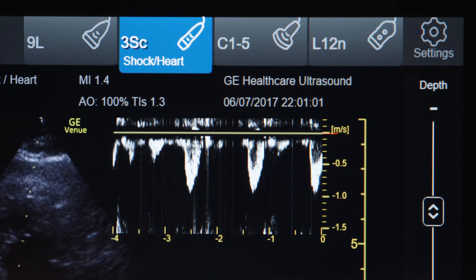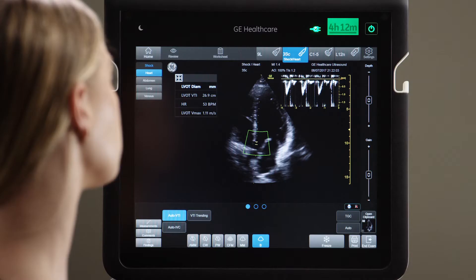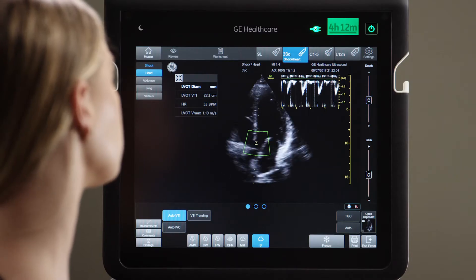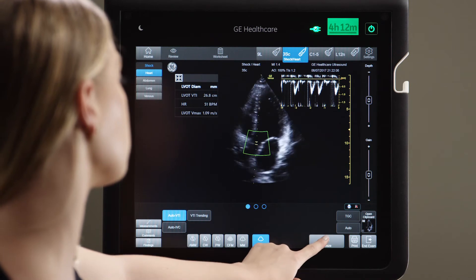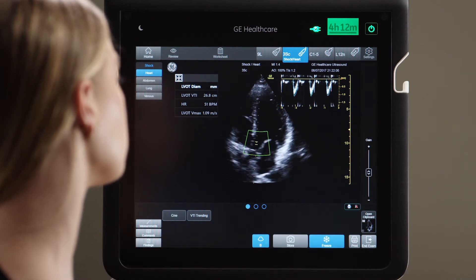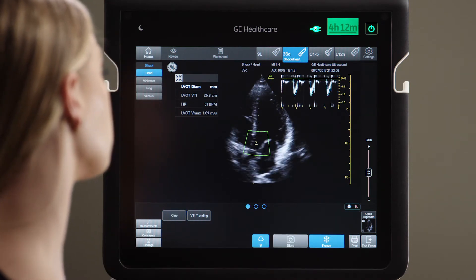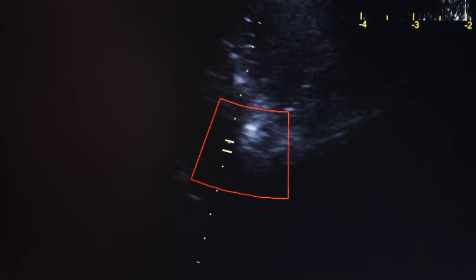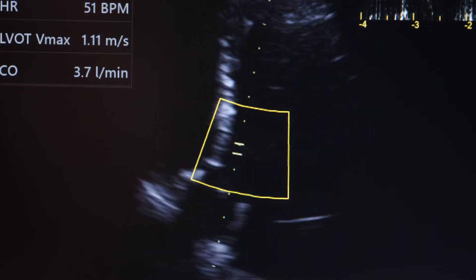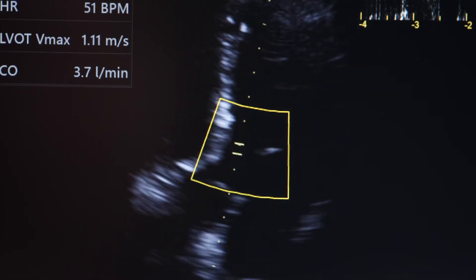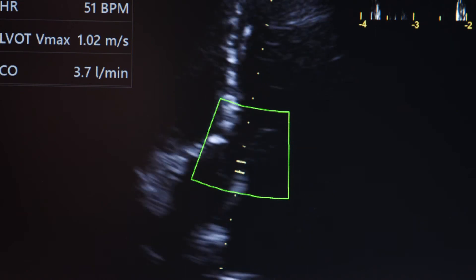Venue displays the Doppler signal automatically. Venue's Auto VTI tool calculates the velocity time integral, or VTI, in a single step. The sample box changes colors, acting as a quality indicator to assist you with image acquisition.